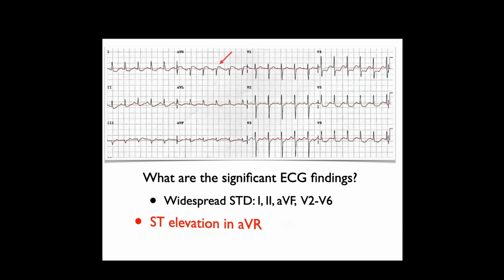Yeah. So, ST elevation in AVR, okay? This is another thing that has changed in the last, I'm going to say 10 years, because I'm not entirely sure how many years, but 10 years is kind of a nice amount. More and more AVR, you know, it used to be the totally useless lead. And now it's like, okay, there are some things we can do with it, okay?